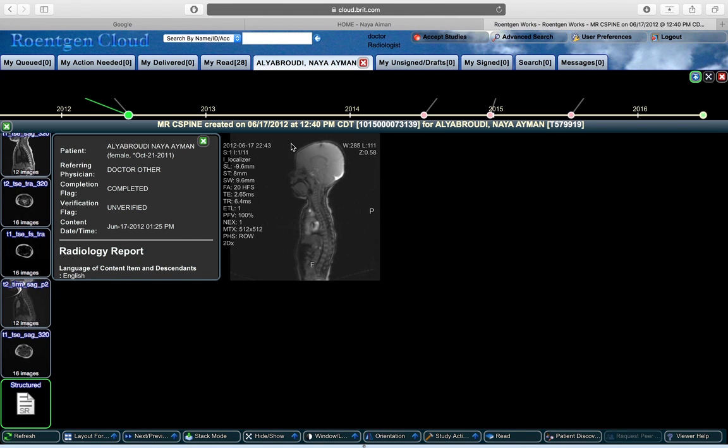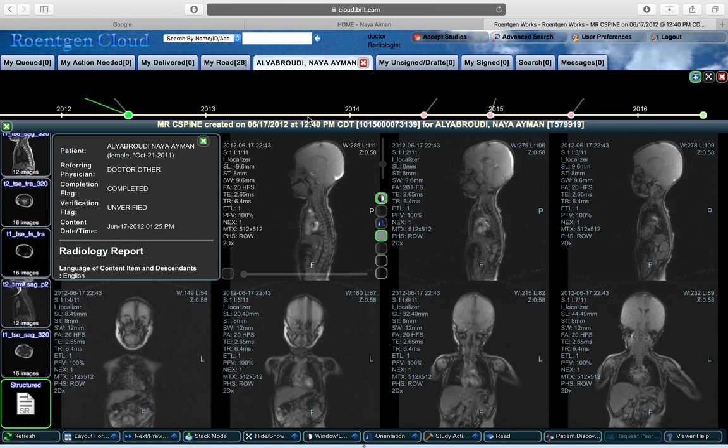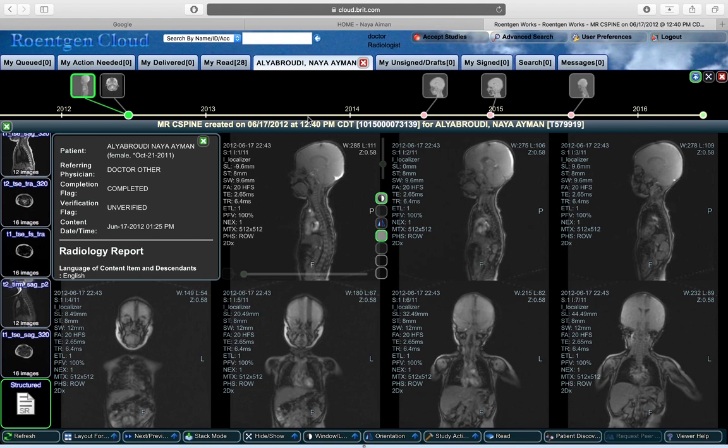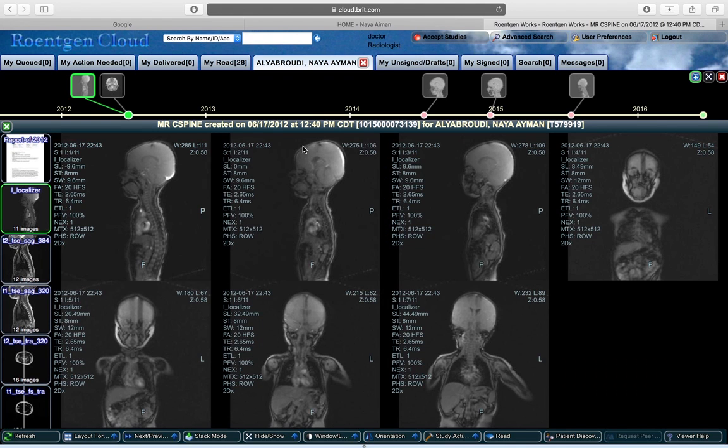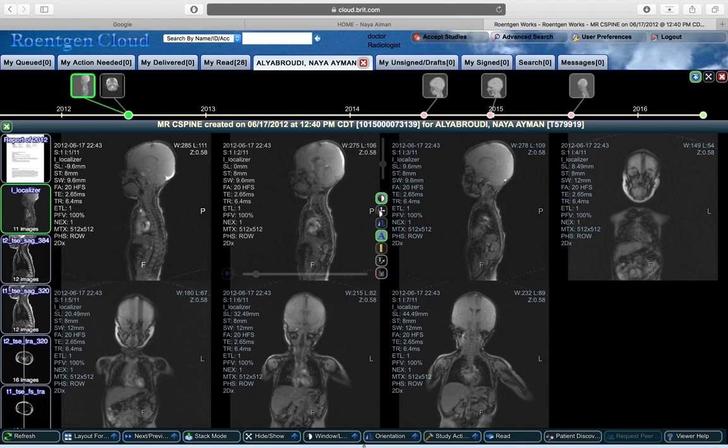From there, you can choose the tools shown here: you can expand images to make them larger, use ruler measurements, or adjust the brightness. Some studies will have reports attached to them.